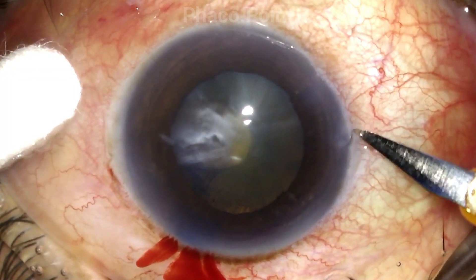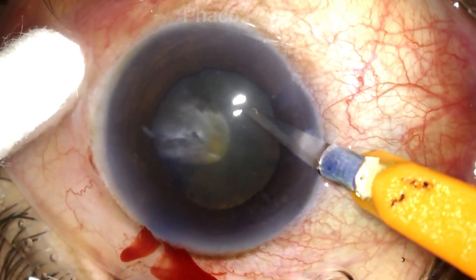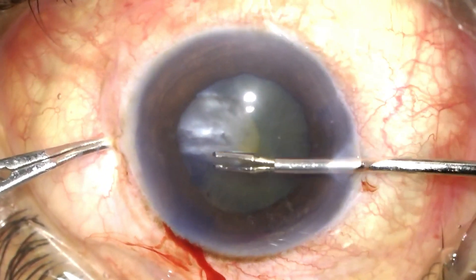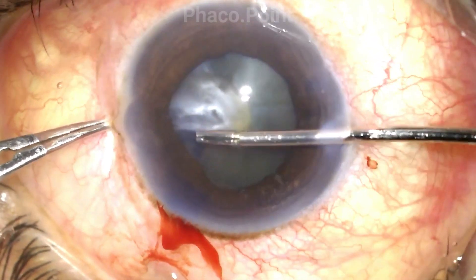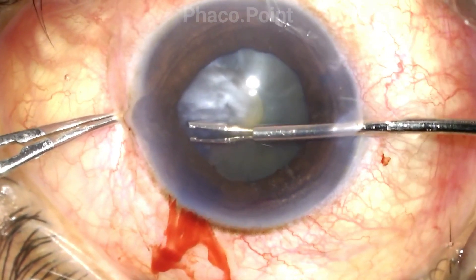The first thing I need to do is enlarge the incision to allow for the intraocular forceps to comfortably go in. Taking the help of the intraocular forceps, which is now introduced from the side opposite to the tear in the rhexis, I try and get a hold of the edge of the capsule and attempt to enlarge this rhexis.